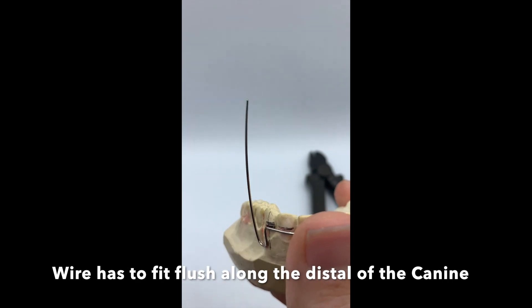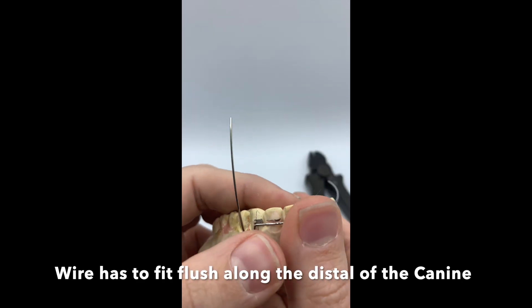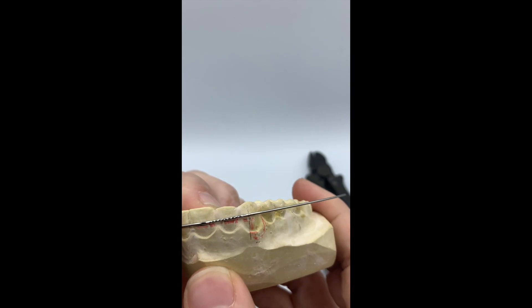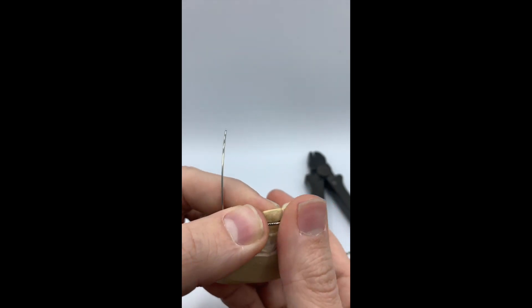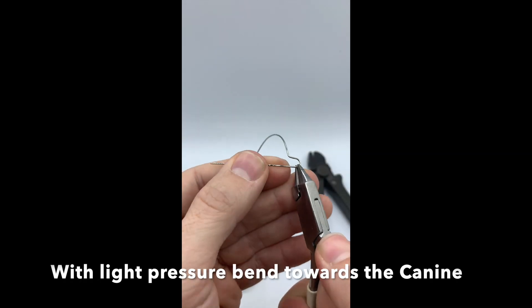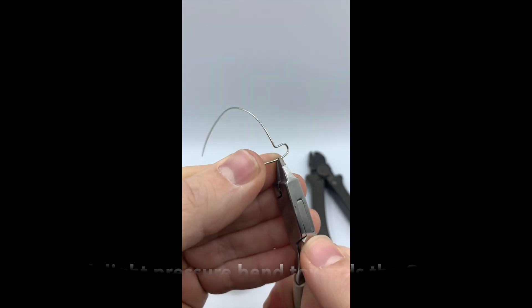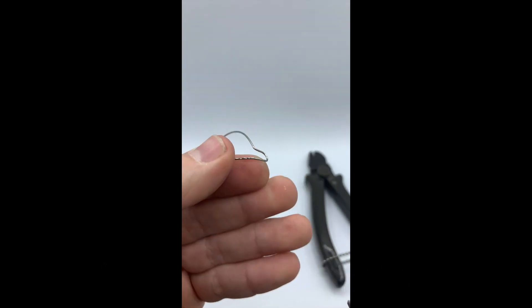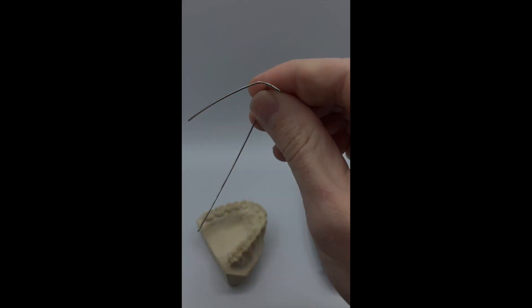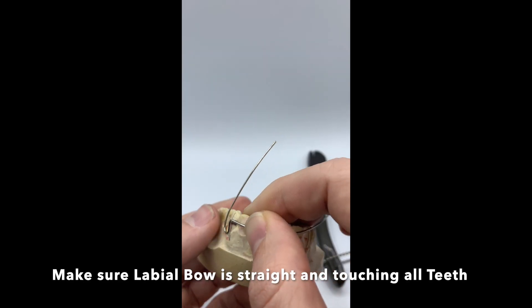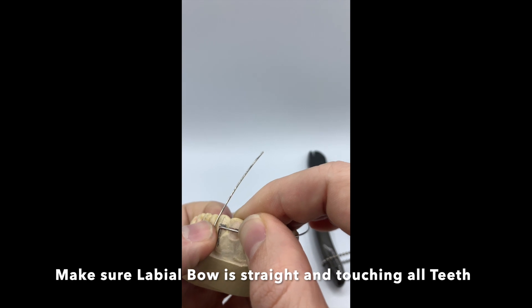We want the wire to touch along the distal of the canine. In a short series of bends with your plier, bend it towards the canine. You want to bend with light pressure so that it is passively touching the canine. Note, always hold the wire with the plier and bend with your fingers.